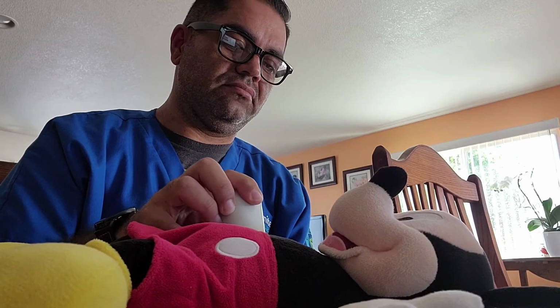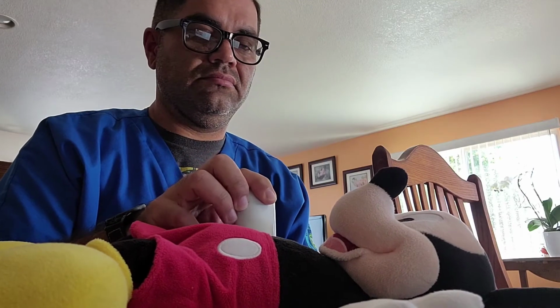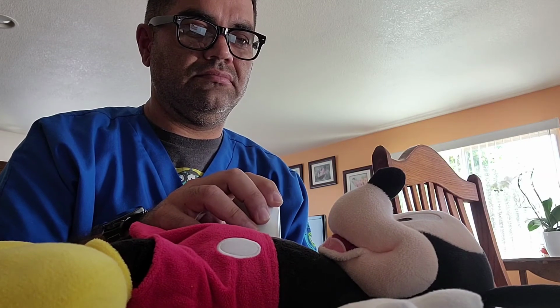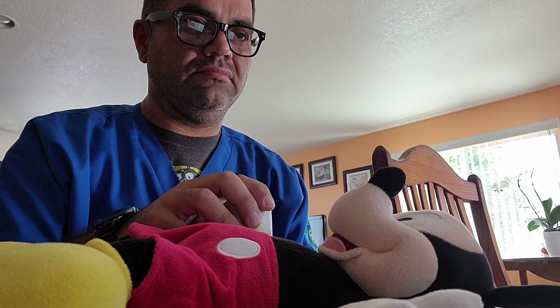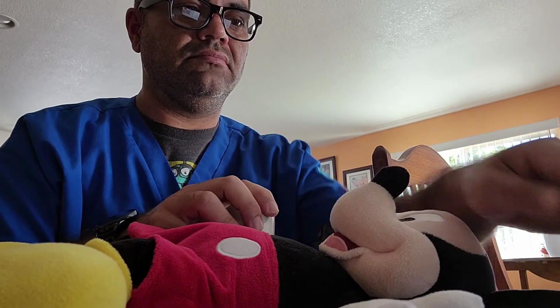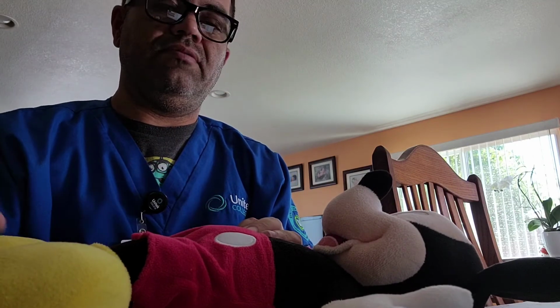Do you hear that? The baby sounds? It's the heartbeat. Awesome. So that's 140 per minute, which is beautiful for the baby. Okay, and we're all done.